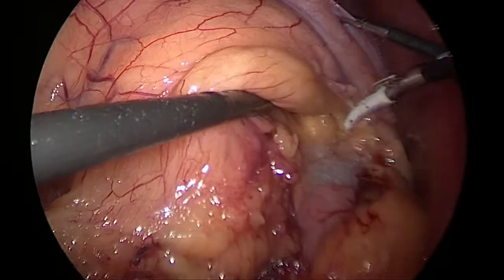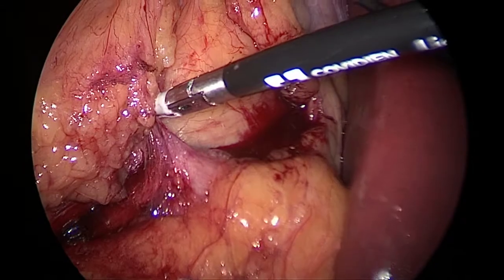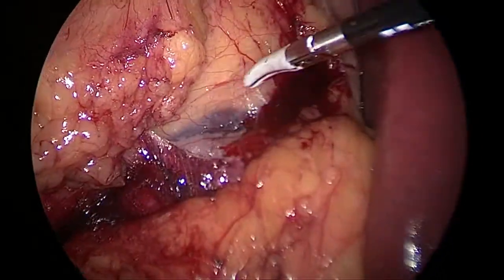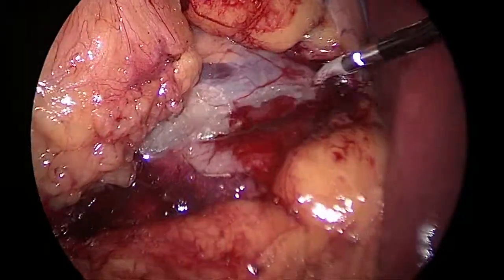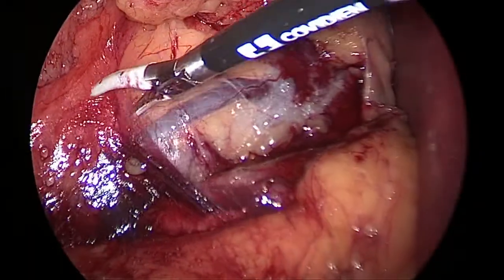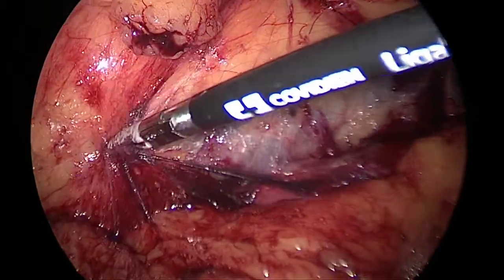I am incising the peritoneal reflection along the undersurface of the liver. You can see the IVC there. Below is the duodenum, and by mobilizing the duodenum we will be able to get the IVC. That is possibly the gonadal vein, which opens into the vena cava. Whenever you get the vena cava, it is easy to get the renal vein. If you follow the lateral border of the IVC, definitely you will get the renal vein.